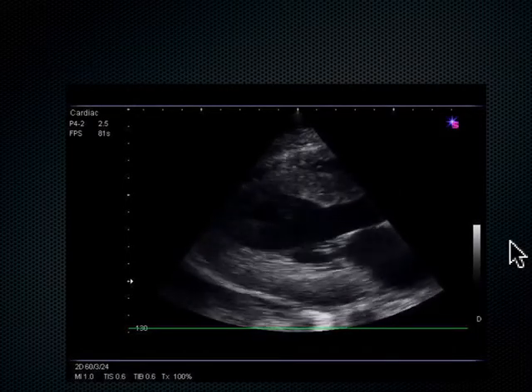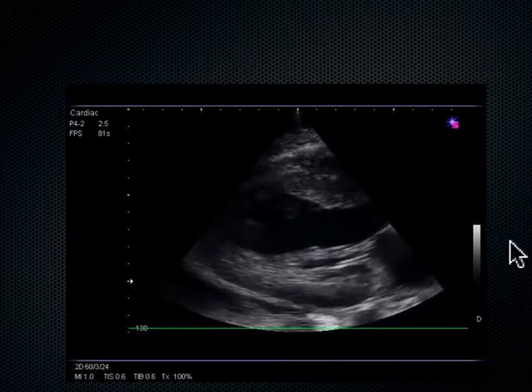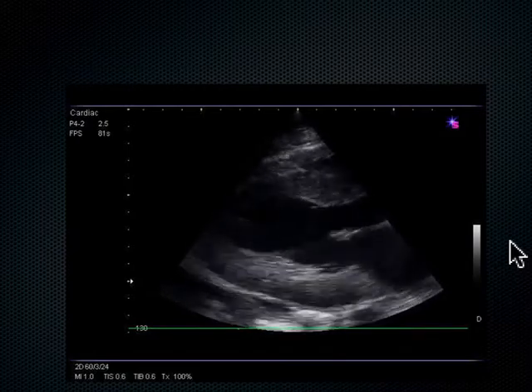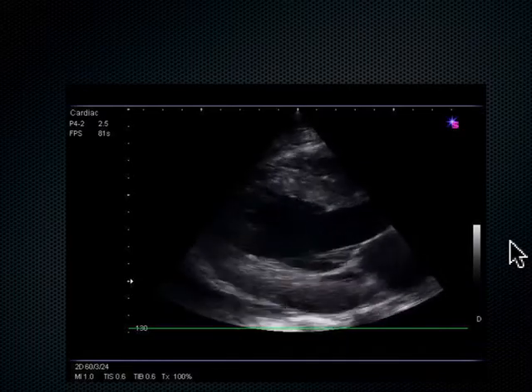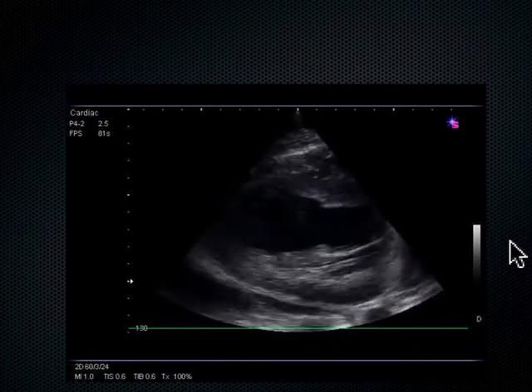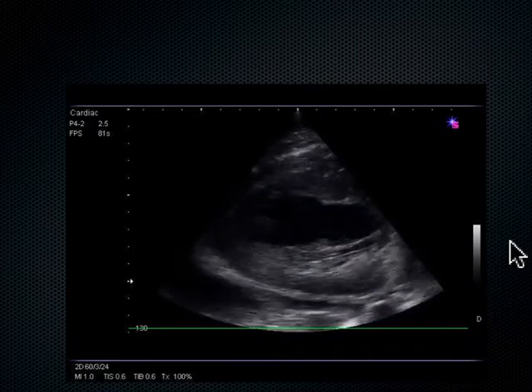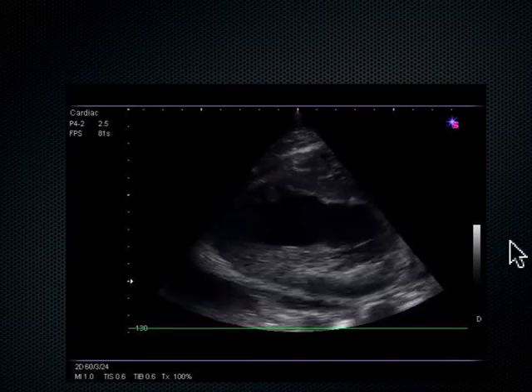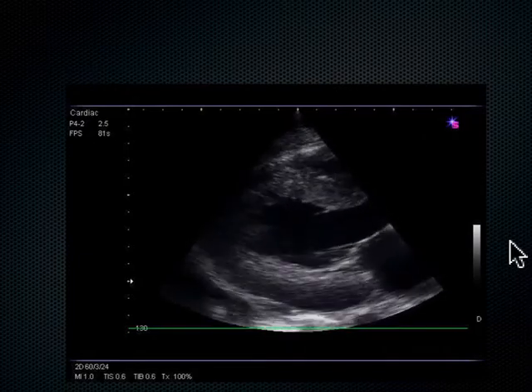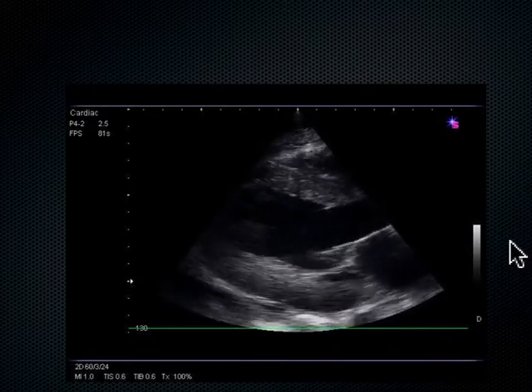And by the way, the reason why I look at that is the physical mechanics of the flow of the blood going from the LA to the LV. As it's being sucked through that valve, it smacks that valve up against the septum. If it's going through with a good enough velocity to do that, good enough pressure change from that LV working so well, it causes that septal leaflet to smack the septum. So when it's not doing that, we know there's decreased LV function.